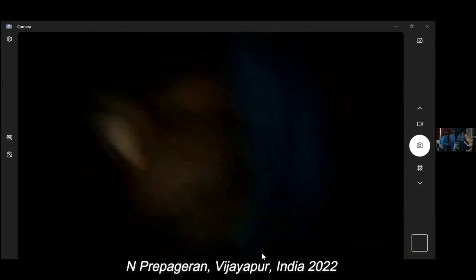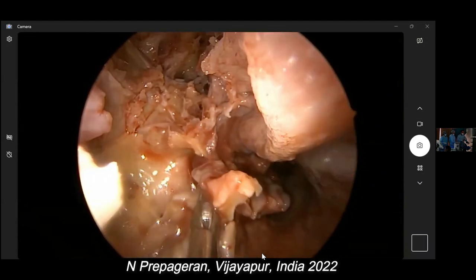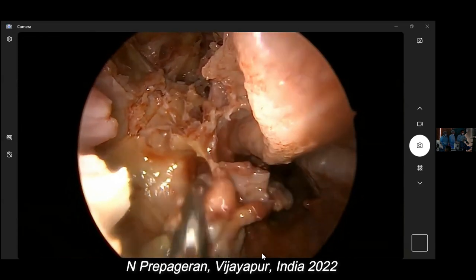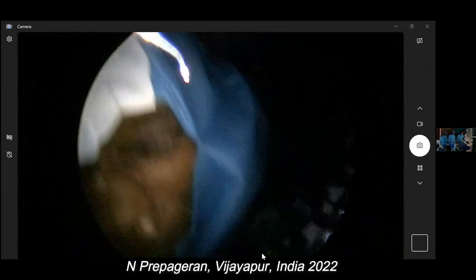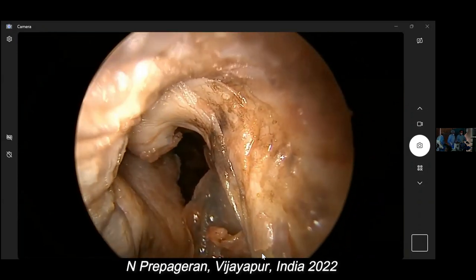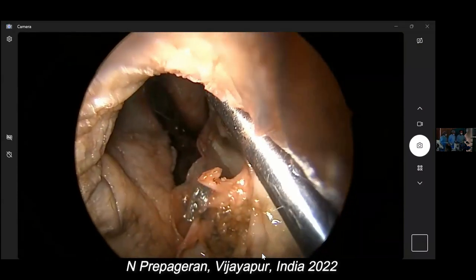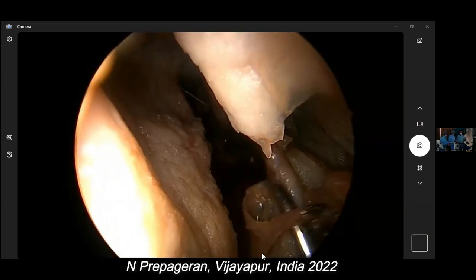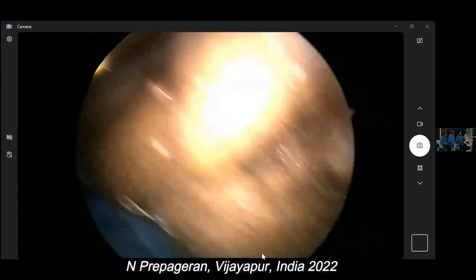Anything not clear, you ask me, yeah? But let's do the dissection step by step, because then it becomes clear. If I start jumping, then the dissection won't be clear. Once you have done this, now you can do Denker's because you want to see extra space. The problem is this septal flap now. You can remove it, sir, if it is in the way. But if I remove this, then I won't be able to do the septal flap. So I'm keeping it for the septal flap so that I can show you how to go into the... See, there's a reason why I do it. Patience, my son, patience.